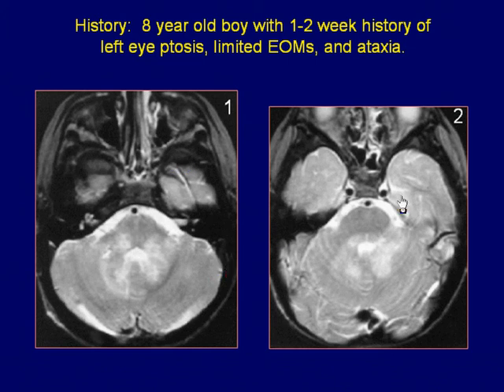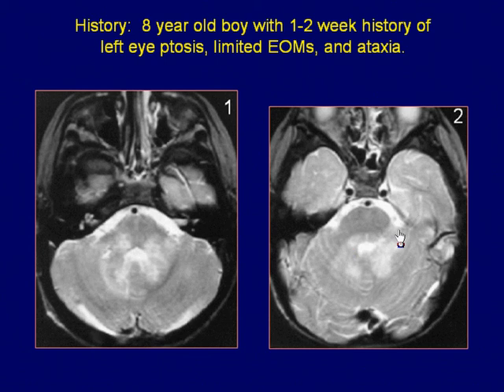Axial T2-weighted images of the posterior fossa demonstrate a patchy area of white matter hyperintensity surrounding the fourth ventricle, involving the brainstem and cerebellum bilaterally.